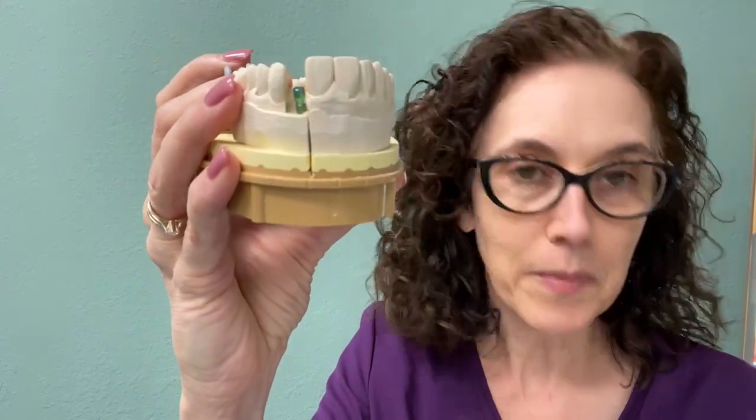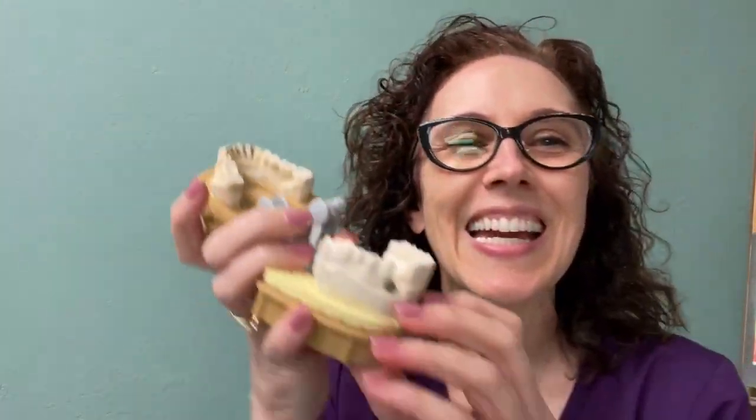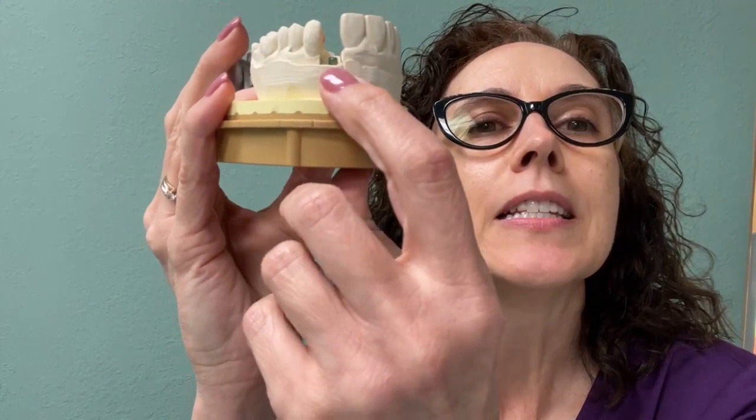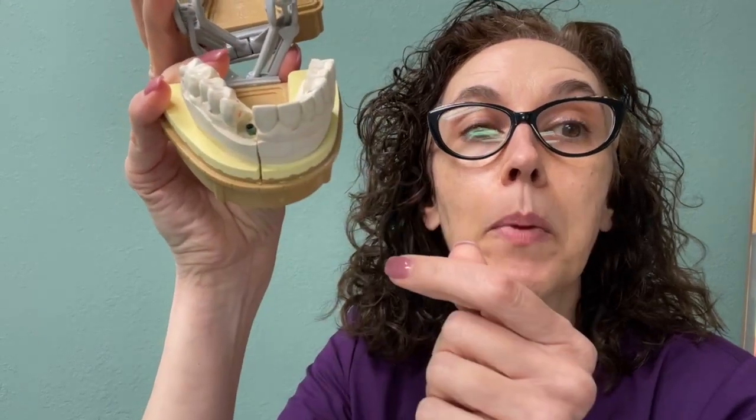And then there's the healing cap that's sticking out of that position. So if I take the healing cap off, you'll be able to see that the implant is really down, because remember the gums are in this position. So the implant is really down in the bone, and that is like a metal post that's down in the bone and you don't see it or know that it's there. Then as this example was, that pink gum tissue would have covered it all up. But you saw that green stick sticking out of there, and that's the healing cap that was in position, allowing the tissue to learn how to treat it.